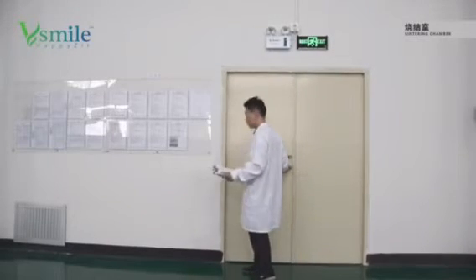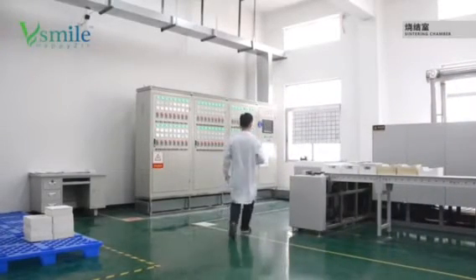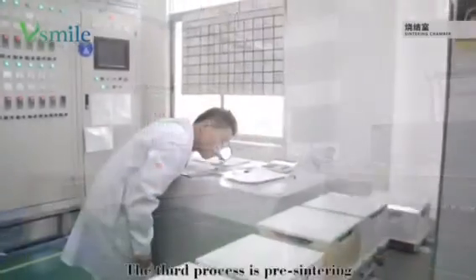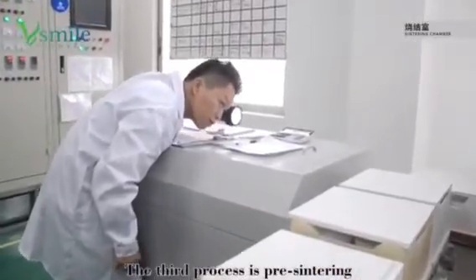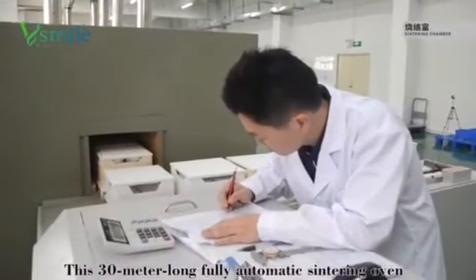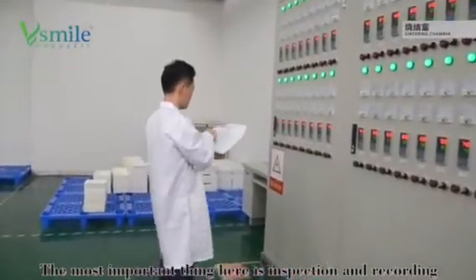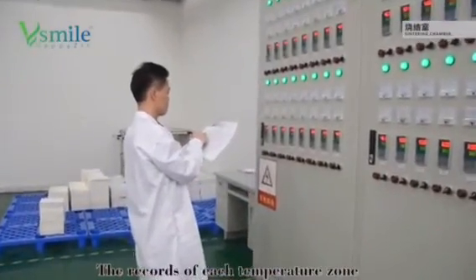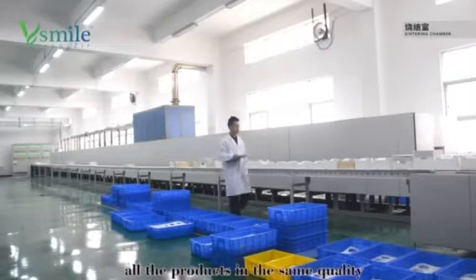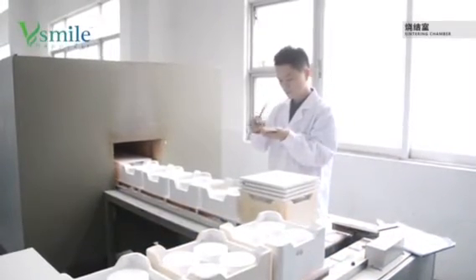After pressing, this is the pre-sintering process — the third process. In China, this 30-meter-long fully automatic sintering furnace is the treasure of our company. The most important thing here is inspection and recording. The records of each temperature zone must be carefully checked to ensure all products have the same quality, so we don't need to worry about delivery time.